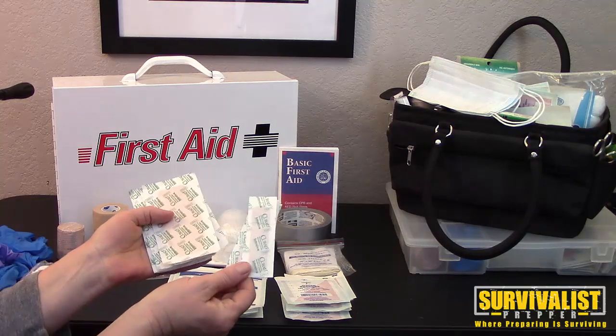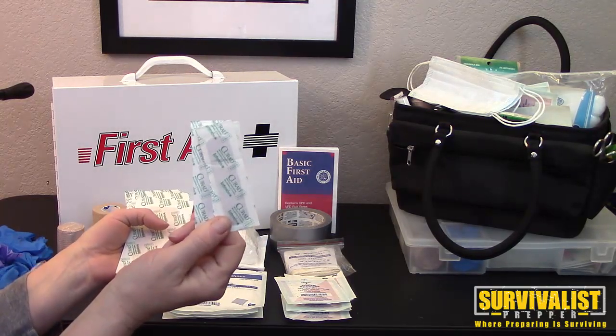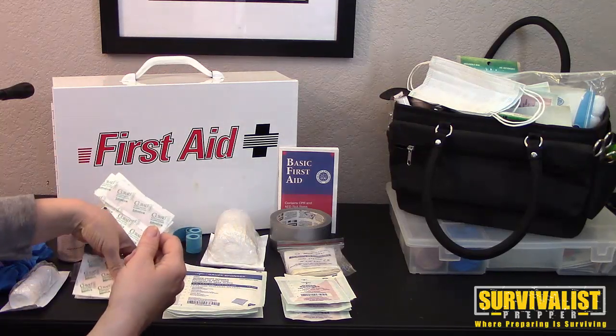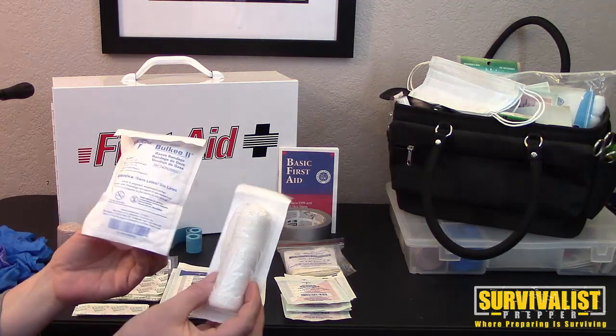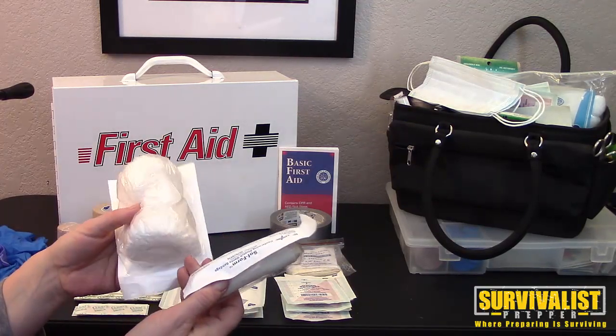Band-aids in different sizes are important to have, because you want the right size band-aid for the right size wound — you don't want to put a small band-aid on a big wound. There are also knuckle band-aids and butterfly band-aids, which stay on better. Different types of clean gauze or rolled gauze are also very helpful to have.